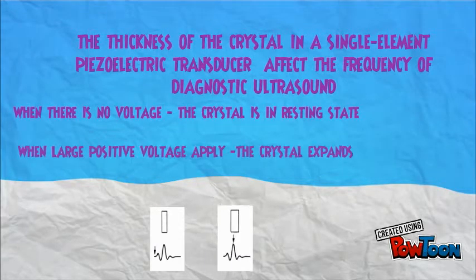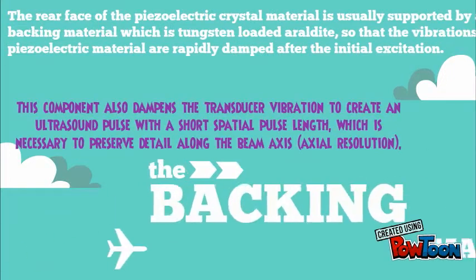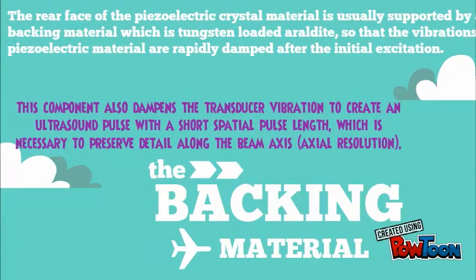The thickness of the crystal affects the frequency of diagnostic ultrasound. Let me explain in a simple way. When there is no voltage applied across the piezoelectric crystal, the thickness of the crystal is in a resting state. When a large positive voltage is applied, the crystal expands, and when a negative voltage is applied, the thickness is contracted. The rear face of the piezoelectric crystal usually is supported by backing material.